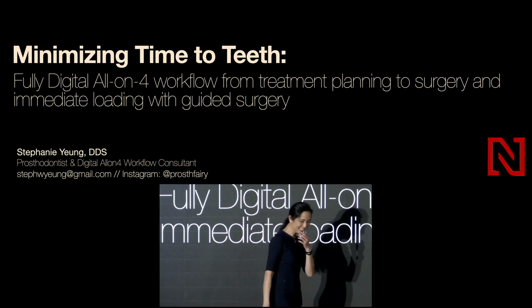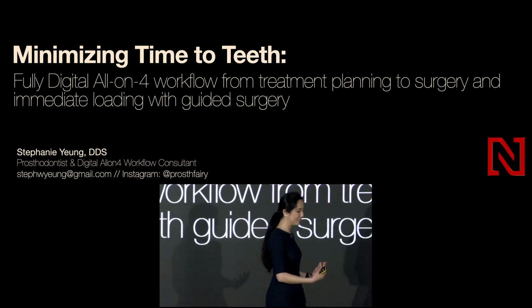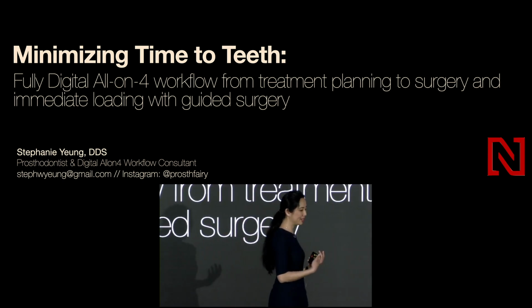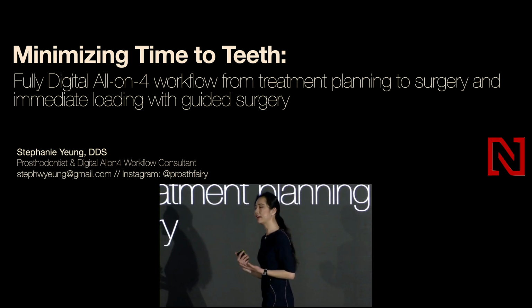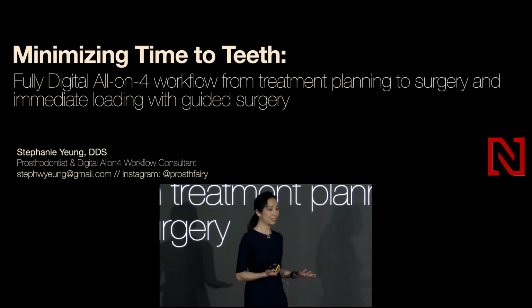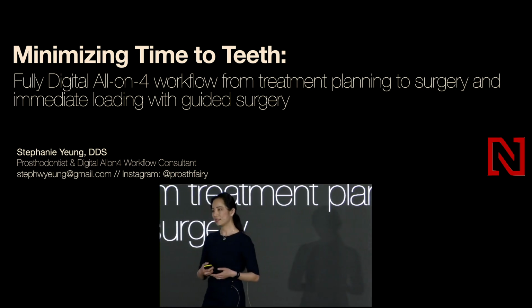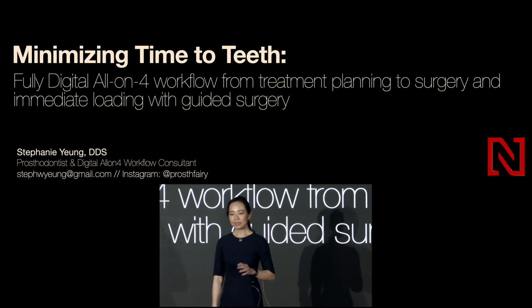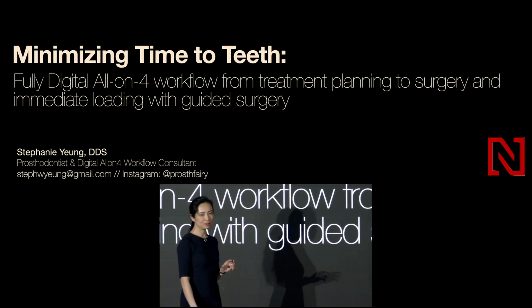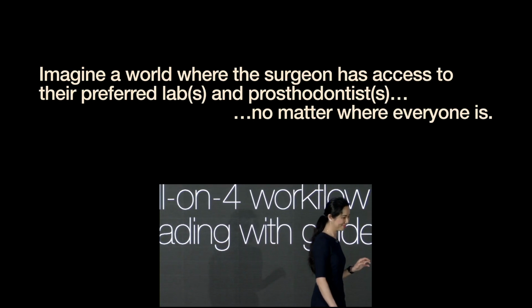So I'm going to get rolling. Basically, this is a follow-up to the previous lecture. I'm going to try to not make it redundant. This is actually just the entire fast mapping workflow from start to finish. For those of you who are not quite sure what fast mapping is, it's the newest extension to the X-Nav. And what I'm going to show you here is how we further the discussion on minimizing errors.